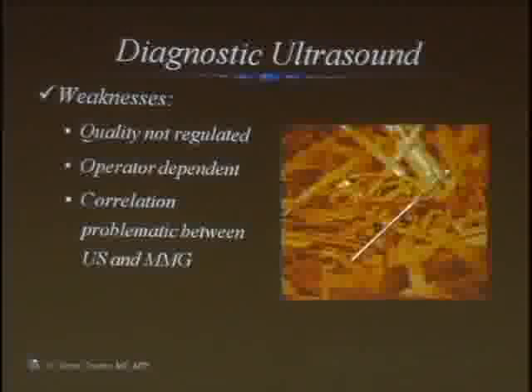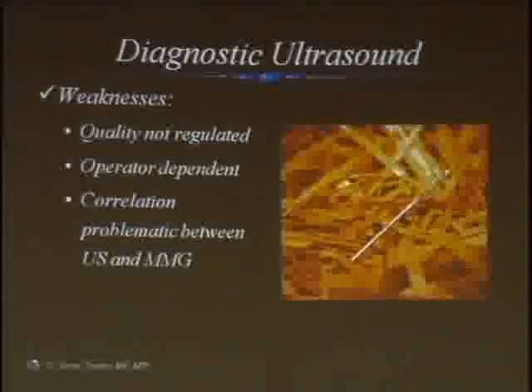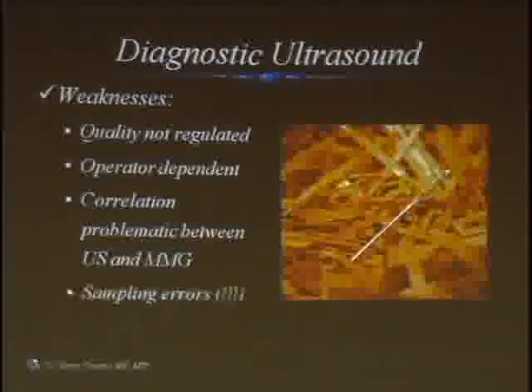In fact, there's a problem. When you're doing standardized views from one modality, mammogram, very standardized views, reproducible, and then you take that breast and you lay the person flat, and the breast is basically, forgive me for being blunt, it's jello, and it changes its shape completely, and then somebody goes and tries to find a needle in a haystack if they don't know what they're doing. If you're really high-end trained, you can find that mass that we talked about on the mammogram, because you can do 3D correlative spatial stuff in your head that you've been taught. But not everybody's been taught this. Okay, so there is a known, even for experts, a correlation problem between mammogram and ultrasound sometimes.